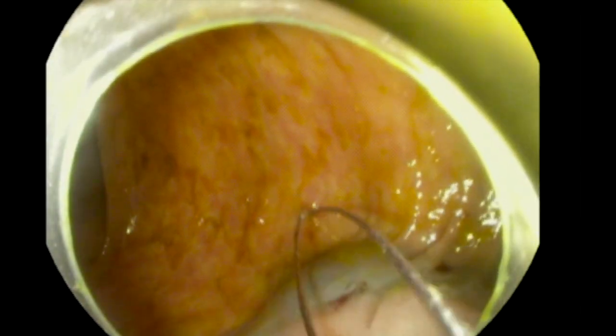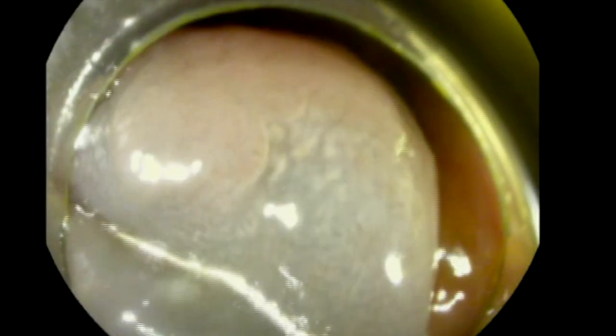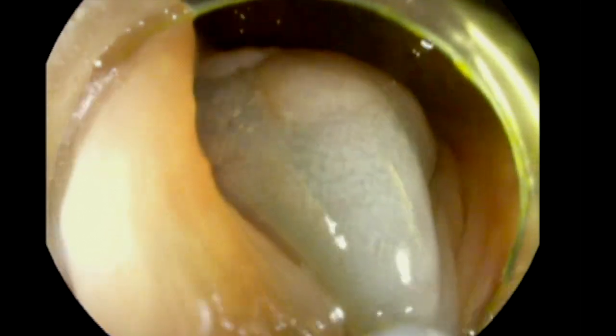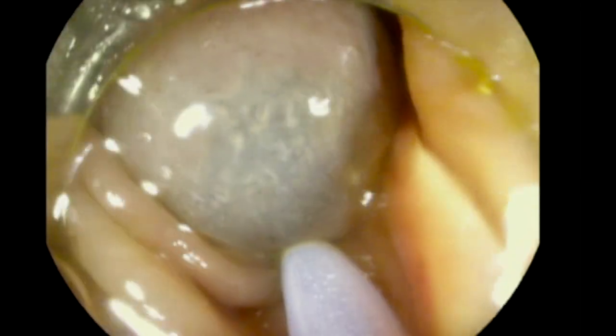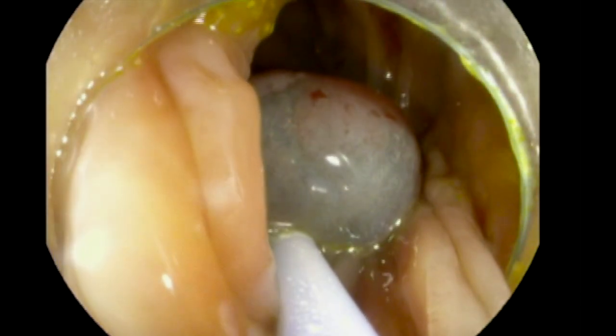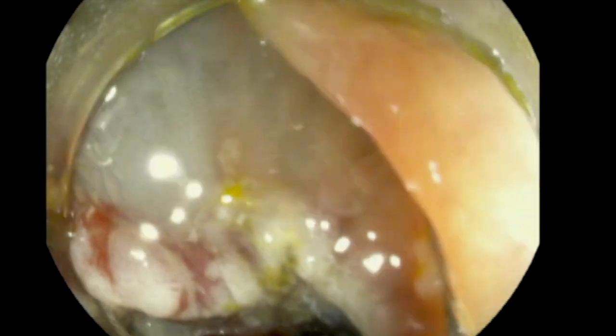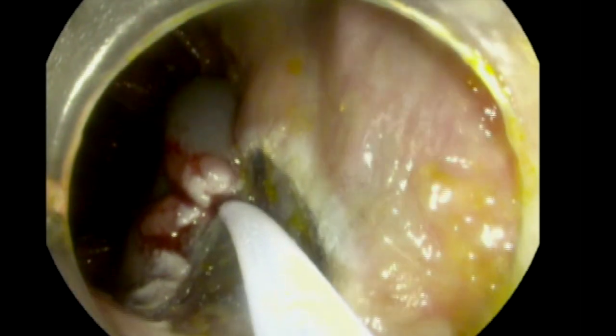The reason I'm doing that is that once we have this very nice, large lift, I want to take as much normal tissue as I can to ensure I have a clean margin. So now we're opening our three-centimeter snare from the front, getting normal tissue. I hope I got all the polyp in the back — we can't be one hundred percent sure with EMR. We'll gradually use endocut Q current and remove the first piece. Then we inspect and find there's still residue, so we remove the back side of the lesion. The more surrounding normal tissue you have, the cleaner your margins will be.